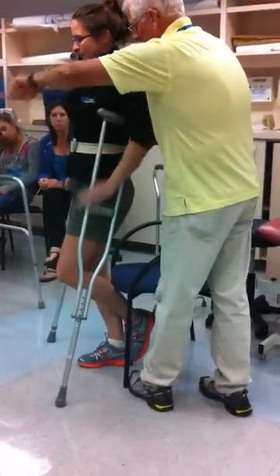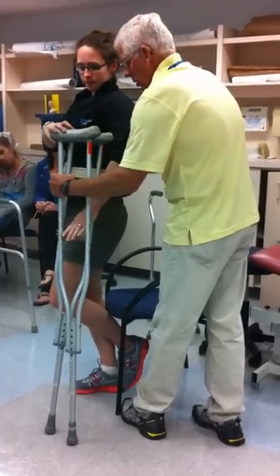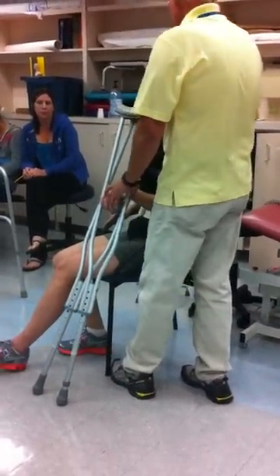Okay. Then you're going to take one and roll it back over. So you leave the other one in? And then you're going to reach through, because you're going to be on the inside. There you go. Reach down. Foot goes out. Good.